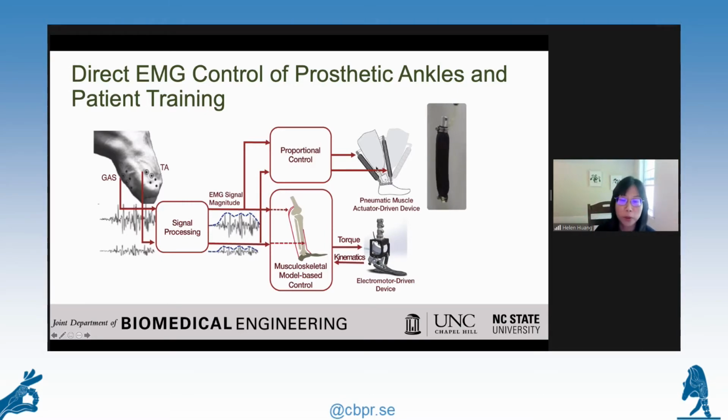the ankle to move. And then we also designed an electromotor prosthetic ankle. In this case, we use a virtual musculoskeletal model to build up the controller, predict the torque, and use that torque to drive the joints.